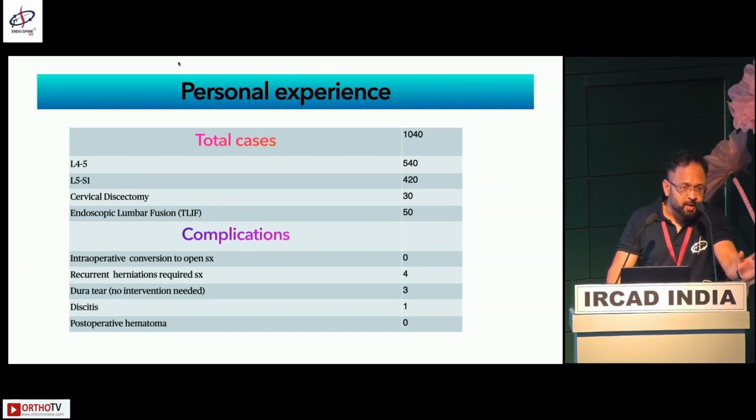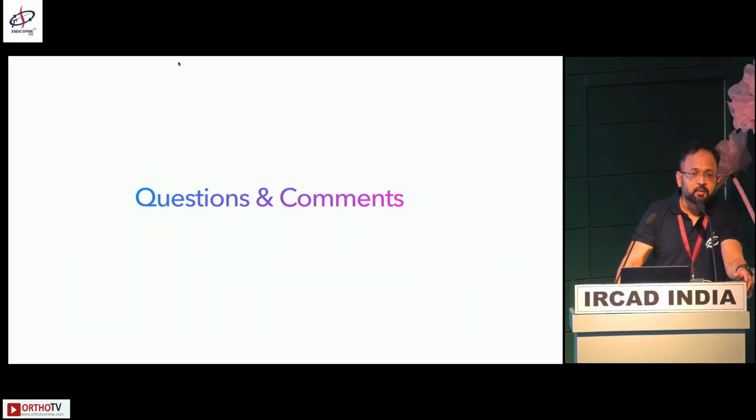If the hematoma is not happening in the first 4 hours, if there is no deficit, no cauda symptoms, no neuropraxia, then 4 hours after surgery, hematoma is a protection. So don't always look at the postoperative MRI and feel hematoma is a risk. Hematoma is a protection for the spine. We'll discuss it once the slides go around. Thank you. This is the evolution of endoscopy.